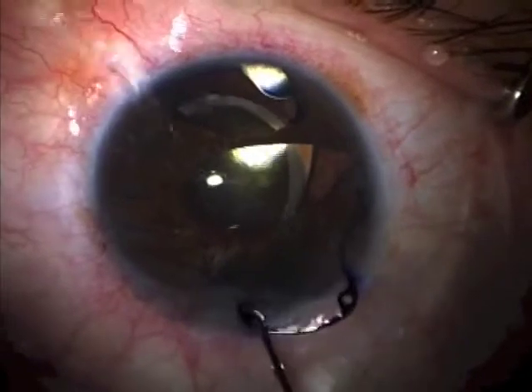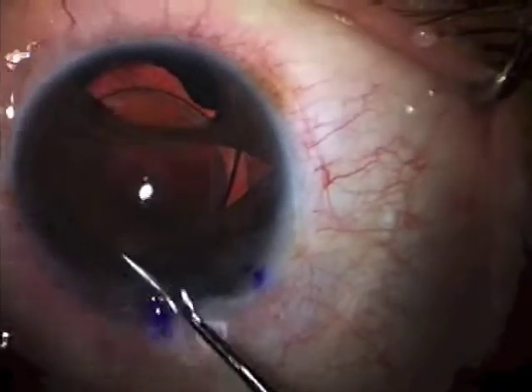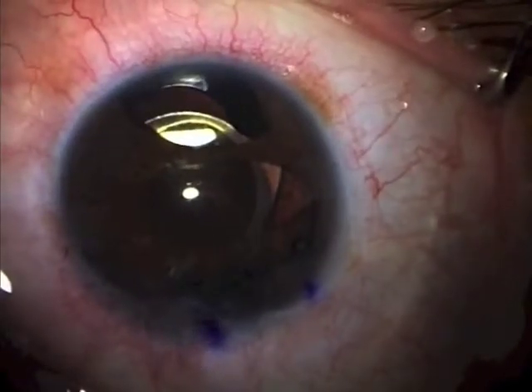With the help of thin forceps and a Synechialysis lens manipulating hook, we introduced the aniridia ring behind the iris.